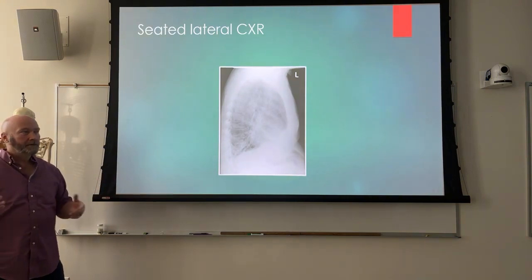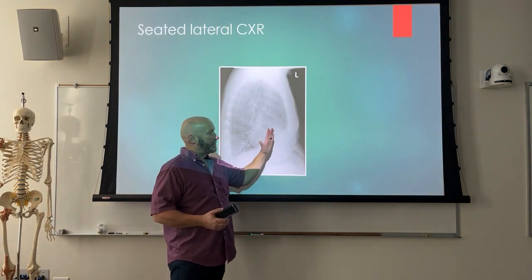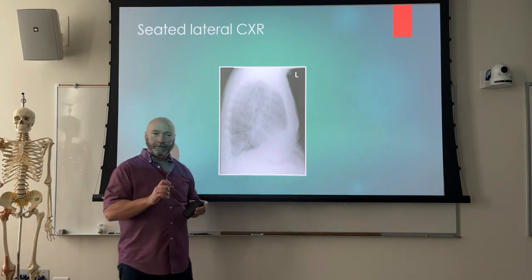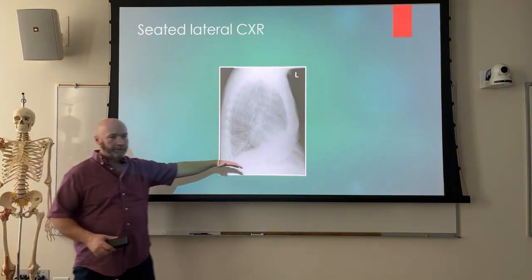If you don't, positioning might get a little dicier. But instead of having the patient sit all the way up, how you can defeat that is to just have the patient lean back a little bit, just a little bit. I'm not talking 45 degrees. I'm just talking about relieving that pressure.